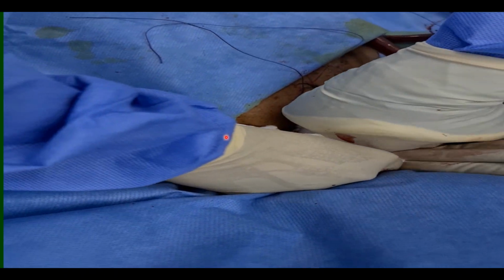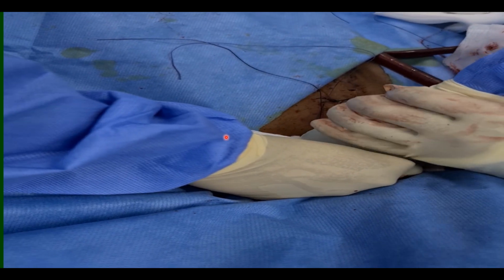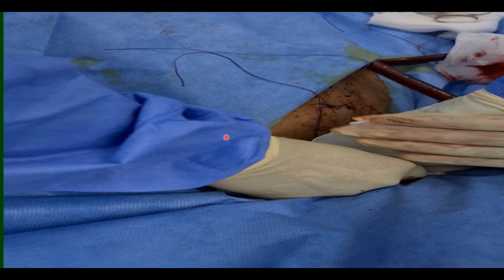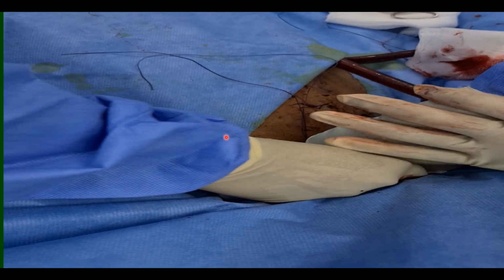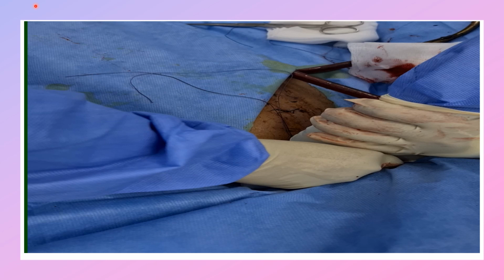After complete decannulation, we should check the limbs by ultrasound and by Doppler to ensure that there is an arterial pulse distal to the limb.